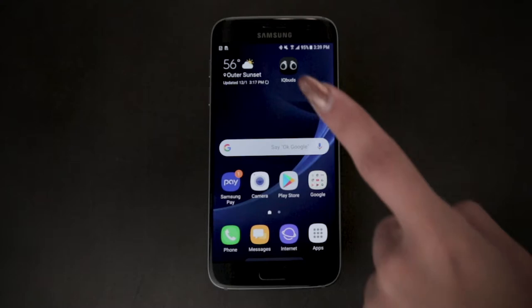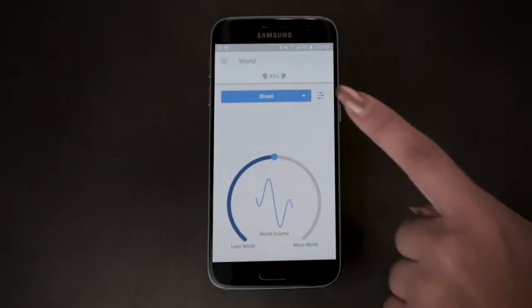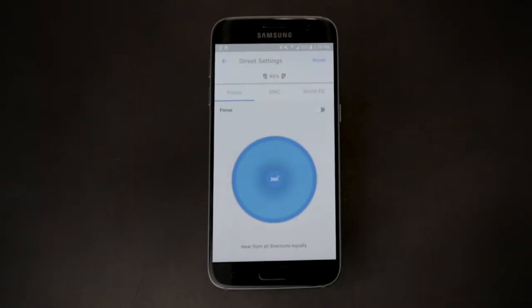It's easy to switch Focus on and off via the app on your phone or by tapping the buds themselves. To get started, make sure the world volume is in on mode. If you click on the menu bars it will open a screen where you can choose to turn Focus off in this location. The default for all other locations is off, so if you want to turn Focus on in other locations you have two options.